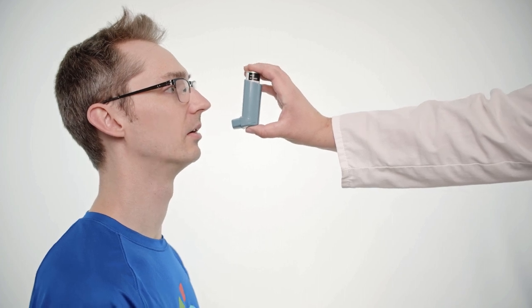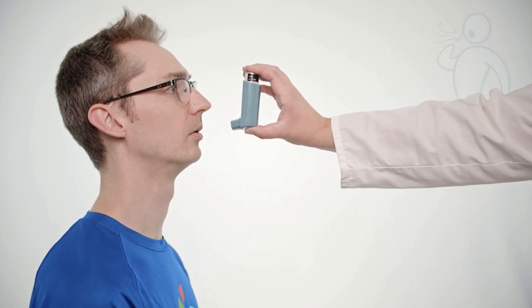Have the patient open their mouth wide and breathe in nice and deep before exhaling completely.